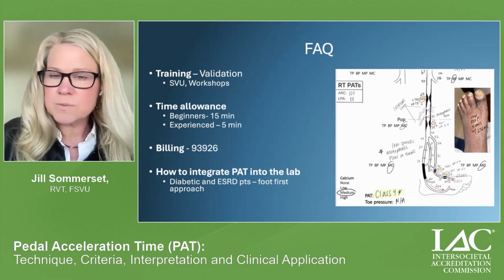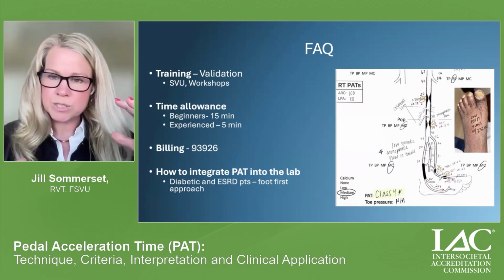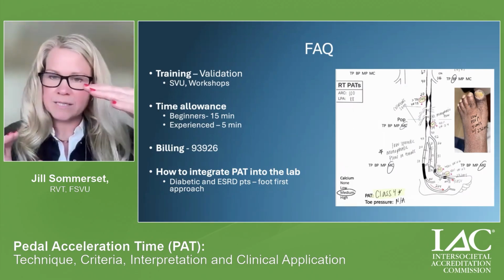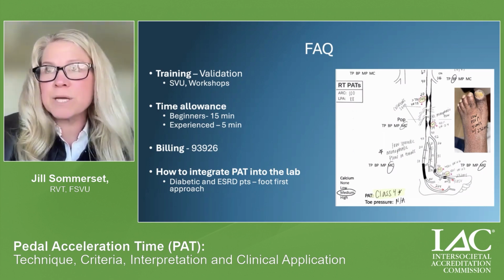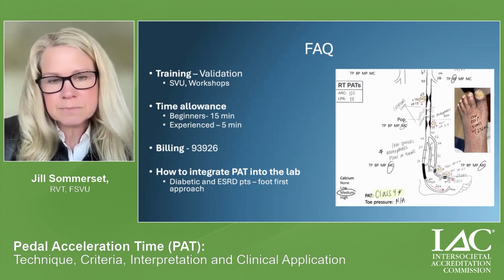In regards to billing code, this is a 93926 billing code if you're doing just the pedal duplex ultrasound from the pedal arch and the distal tibials. If you're doing a full arterial duplex and the foot, it's all one billing code.